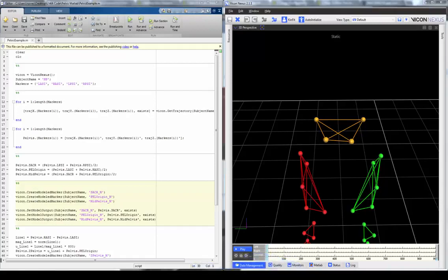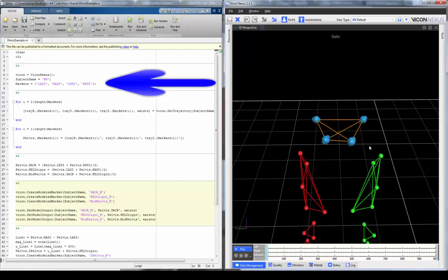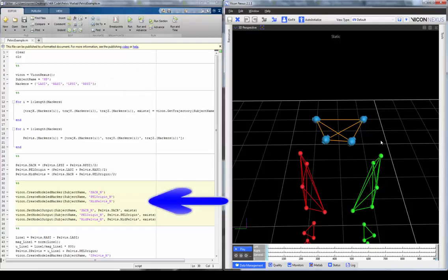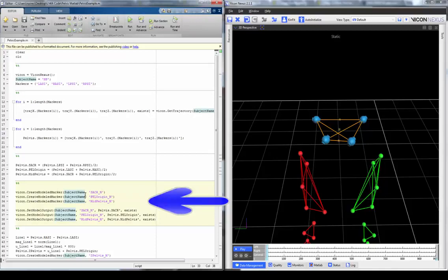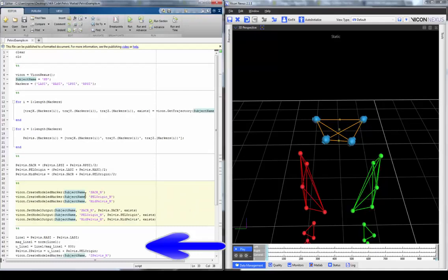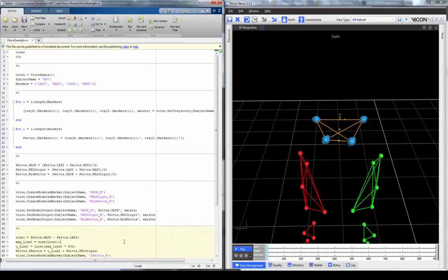I'm going to show you a simple example script where we use the trajectories of the four pelvis markers to create the sacrum, mid pelvis, and pelvis origin modeled markers. Then we're going to create a coordinate system at the pelvis origin, and finally output these directly to the C3D file as modeled markers.